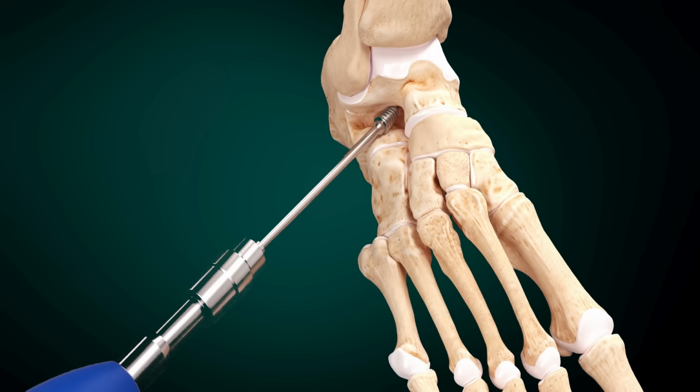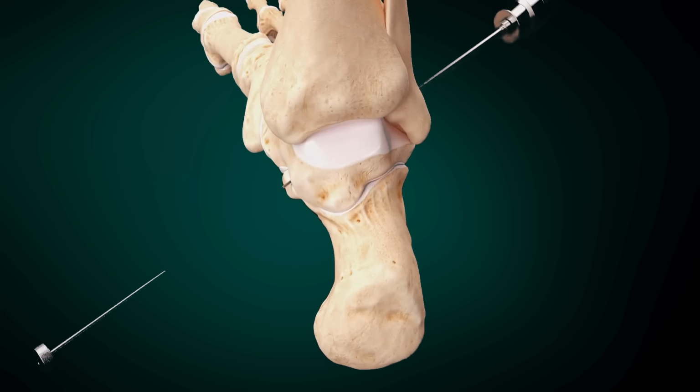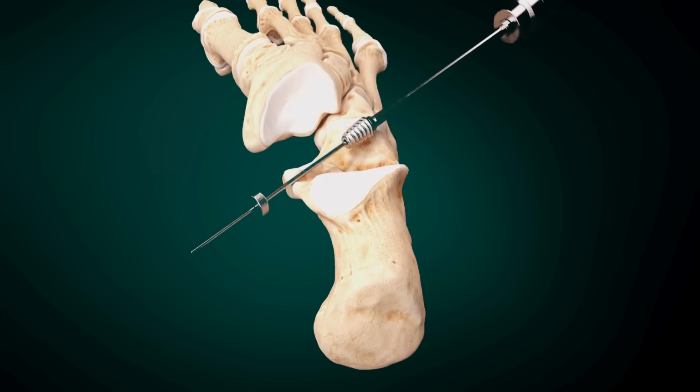If the implant is turning idly without moving towards the skin incision, the Prostop arthroereisis extraction tamp can help to push the implant from medial. Advance the K-wire to medial and incise where it tents the skin. Slide the extraction tamp from medial over the guide wire and push the implant while turning it counterclockwise with the driver.